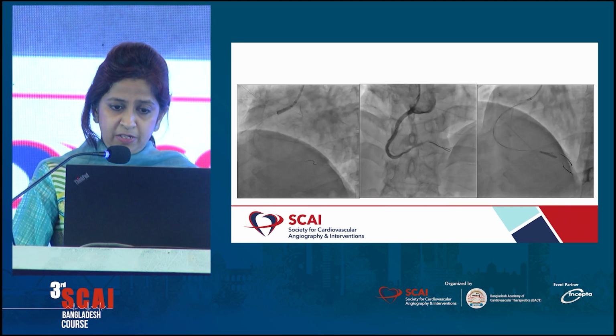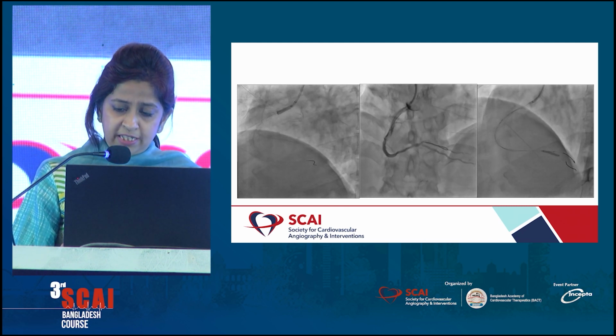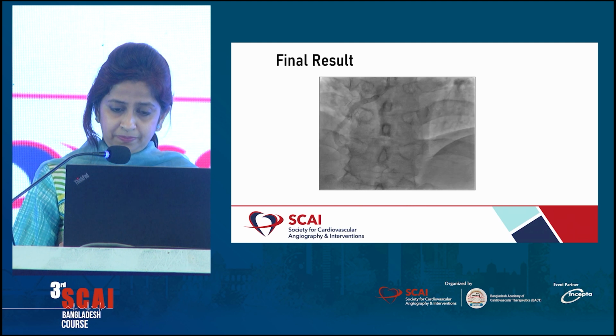And after that, this is the picture. Both dissection and perforation sealed, and there seems to be a significant lesion in the ostial part of the RCA. So another stent was required, and this is the final picture.